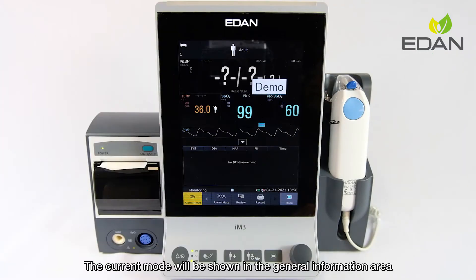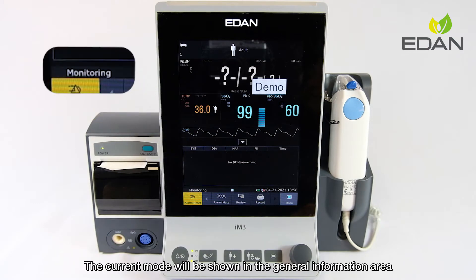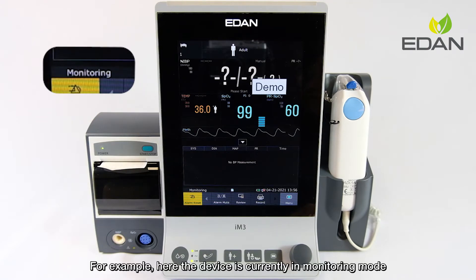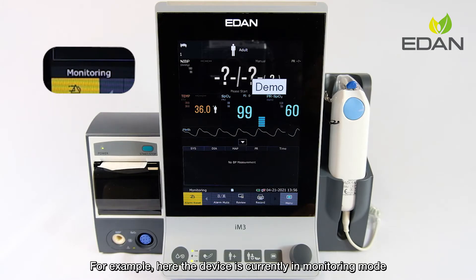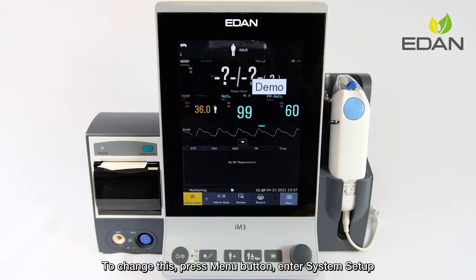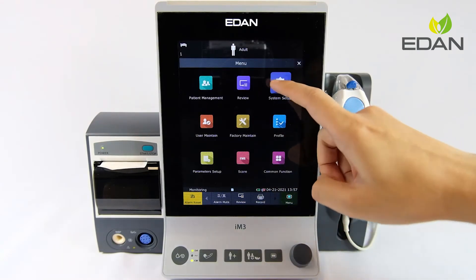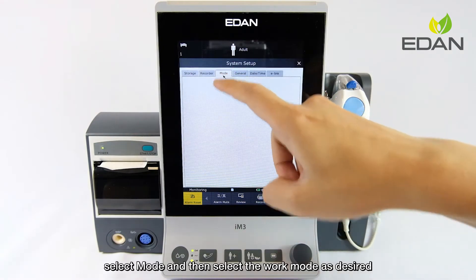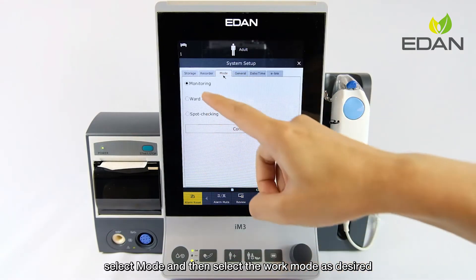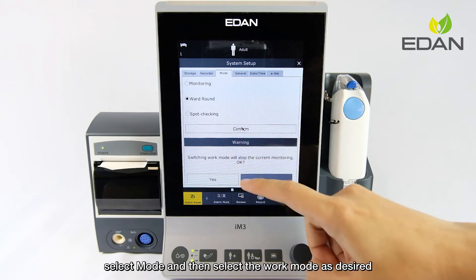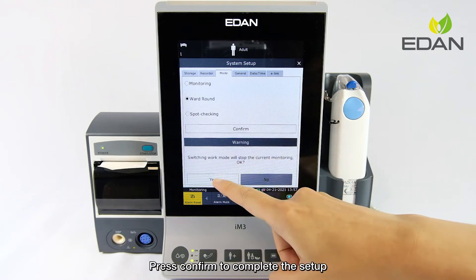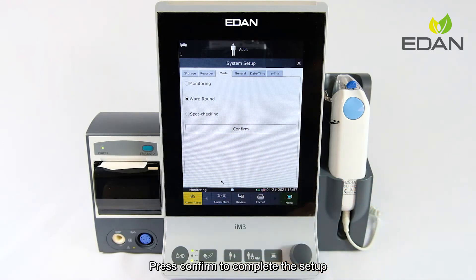The current mode will be shown in the general information area. For example, here the device is currently in monitoring mode. To change this, press the menu button, enter system setup, select mode, and then select the desired work mode. Press confirm to complete the setup.